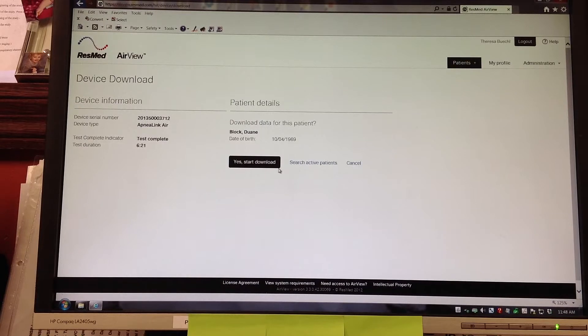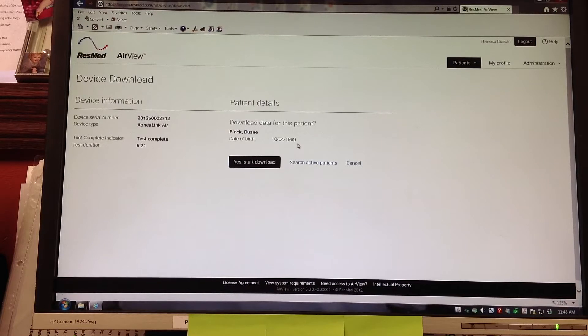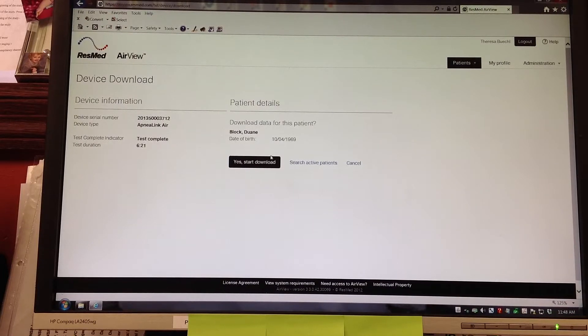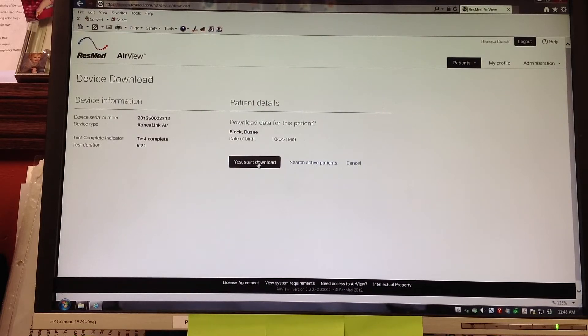This has now shown that this is the patient which we put in the system, Dwayne Block who is an employee here, his date of birth, and is going to ask if we want to start the download. Teresa is going to select yes, start download.